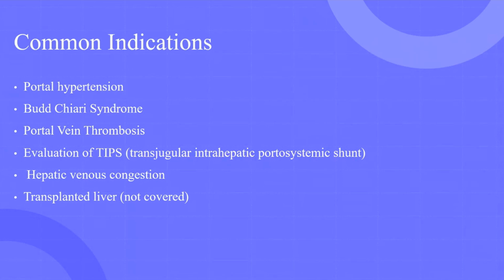The common indications for a liver Doppler study are portal hypertension, Budd-Chiari syndrome, portal vein thrombosis, evaluation of TIPS, hepatic venous congestion, and transplanted liver. The transplanted liver is not covered today as we seldom have such cases in our center.